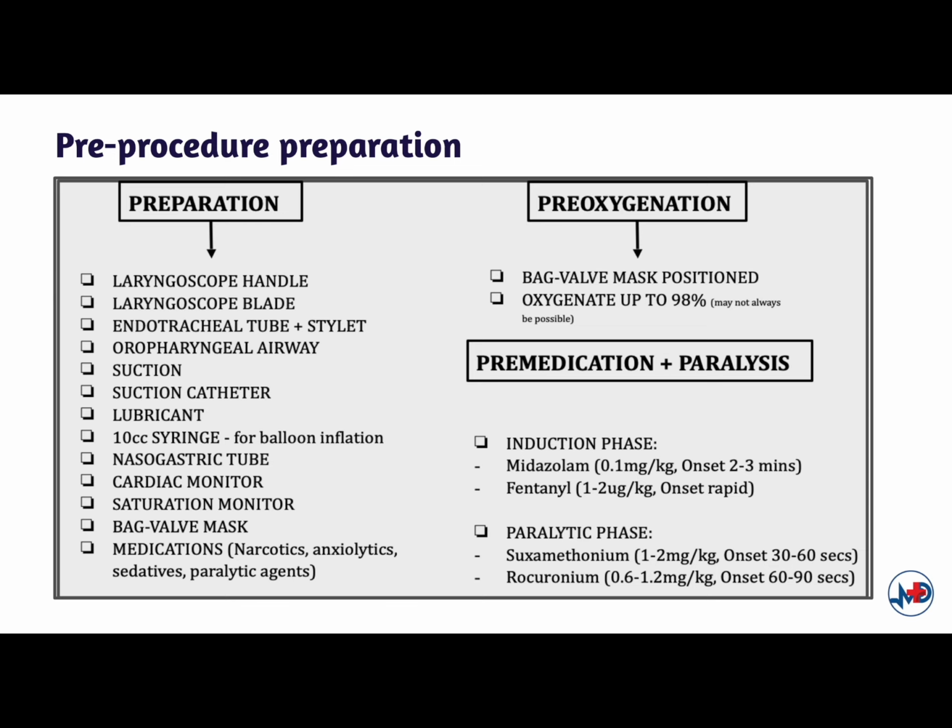For pre-oxygenation, ensure that the bag valve mask is positioned well. Oxygenate up to 98% or more. And for pre-medications, there are two sets of medications that need to be prepared, which is medications for the induction phase, including fentanyl and midazolam, and the paralytic phase, which includes suxamethonium or rocuronium.